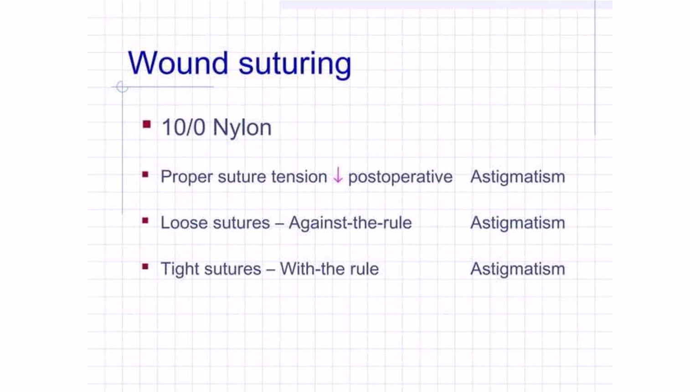Wound suturing in SICS and phaco is not required. It is required in the conventional ECCE. Sometimes if there is a problem with the wound or some eventful surgery has happened, then wound suturing can be done. And what is the suture used? We used 10-0 nylon.